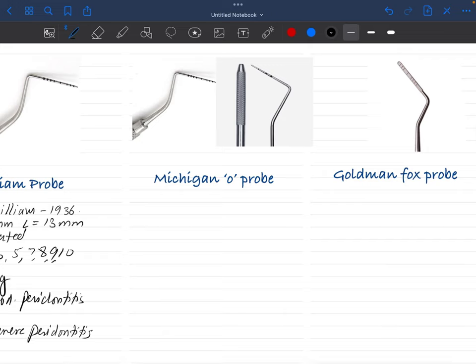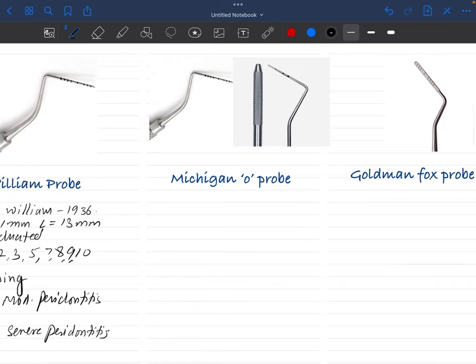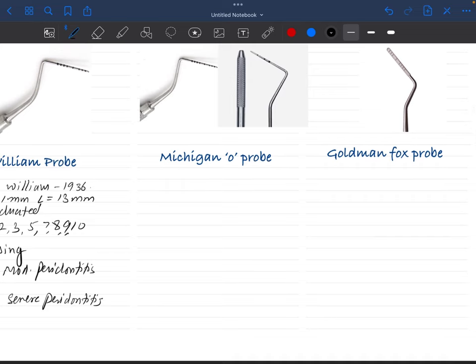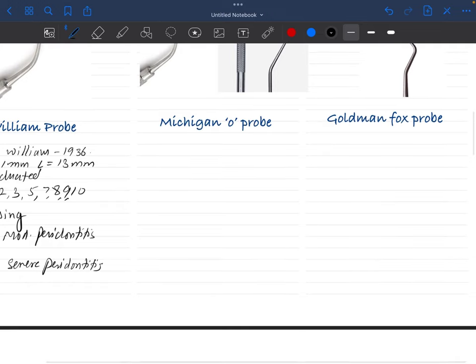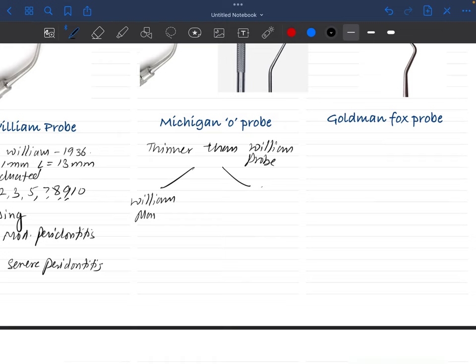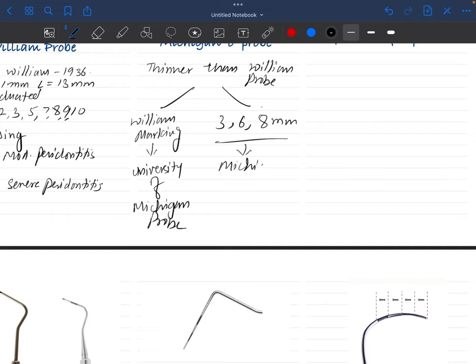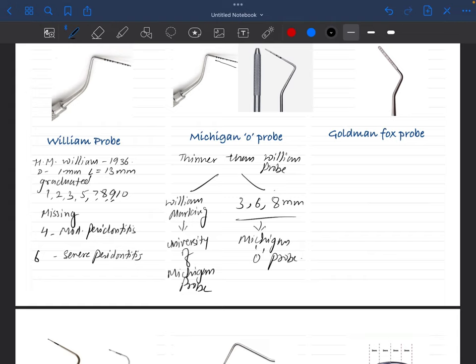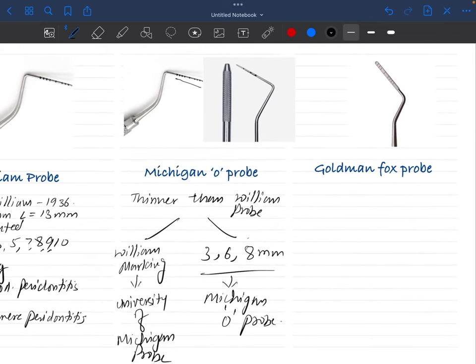Now we have the Michigan probe — it is also a graduated probe. There are two variants of the Michigan probe. The first is the Williams marking probe, which is thinner than the Williams probe. The other variant has markings of 3, 6, 8 mm. When you have two probes in front of you, the Michigan probe will be the thinner one and the Williams probe will be the thicker one; otherwise they look the same.